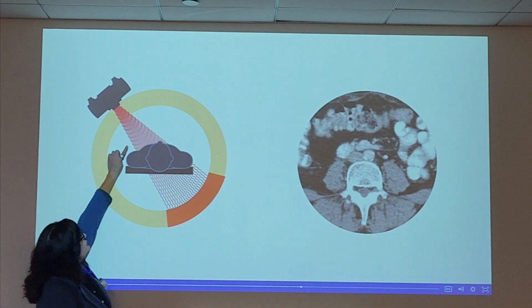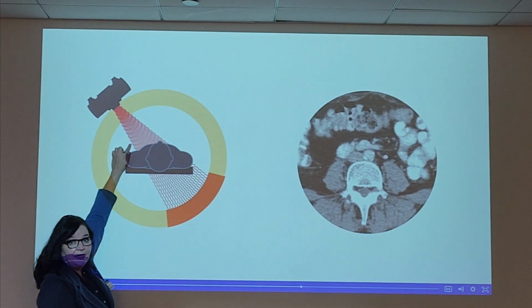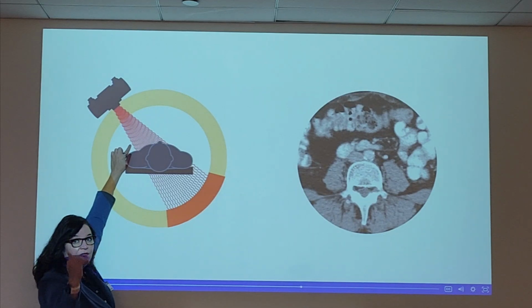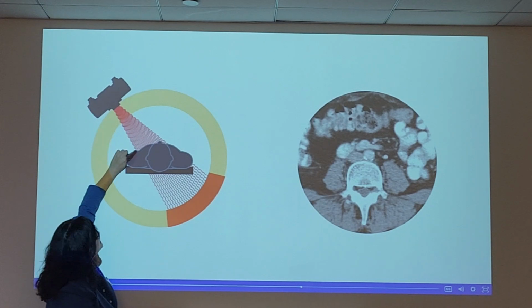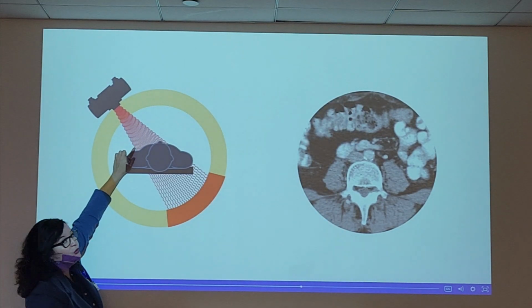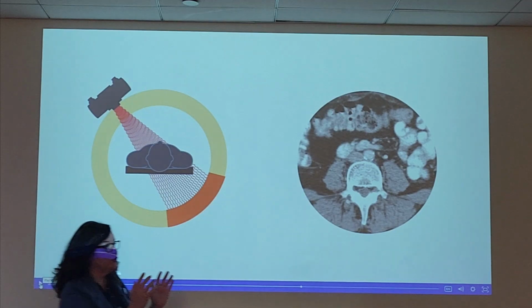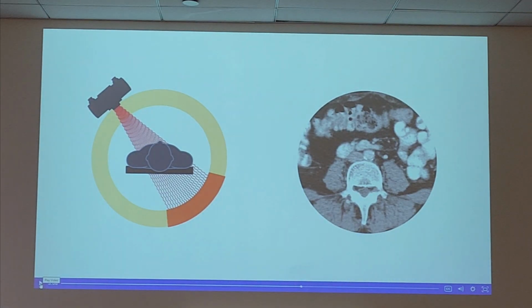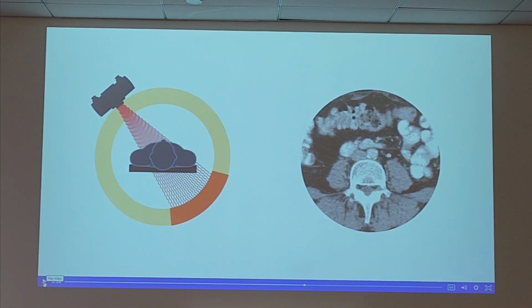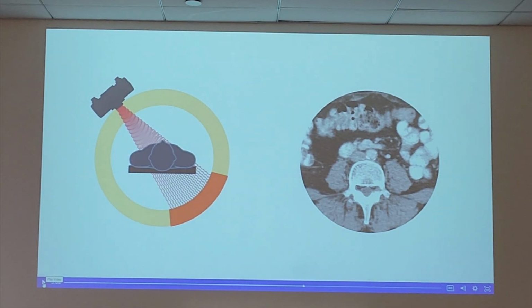These are wavelengths coming from the X-ray source, which is the tube. Look at the wave quantity. How many waves from the X-ray source to the body? The more waves you have in that distance, the higher the energy. This symbol of each wave has closer and closer crests and troughs, or crests and valleys, whatever you want to call it. When they're closer together, the energy is higher. That means more frequency per second.